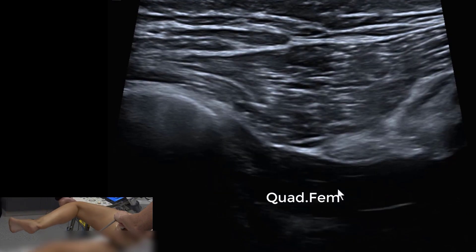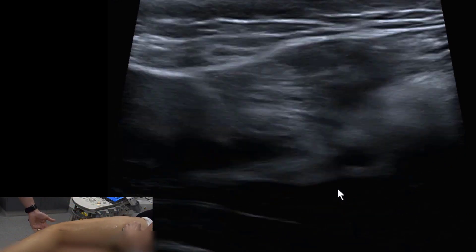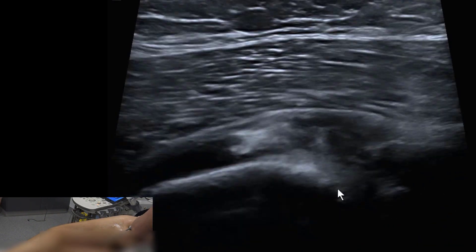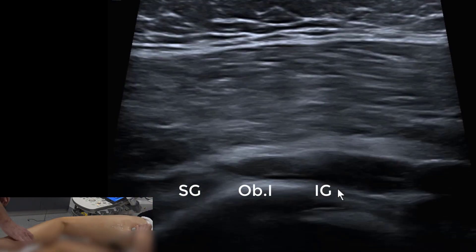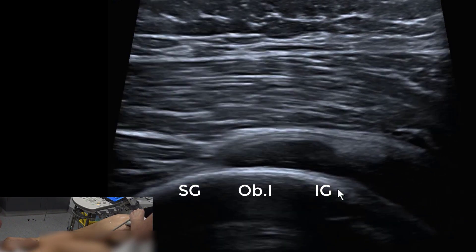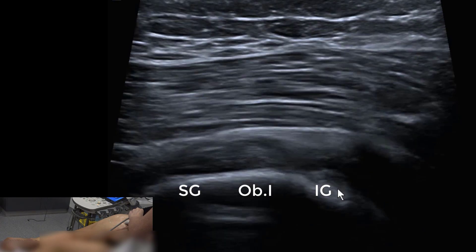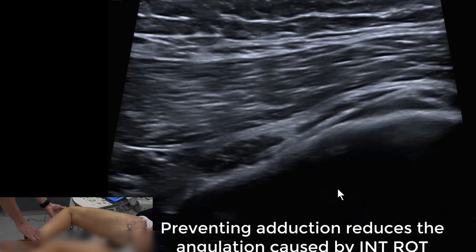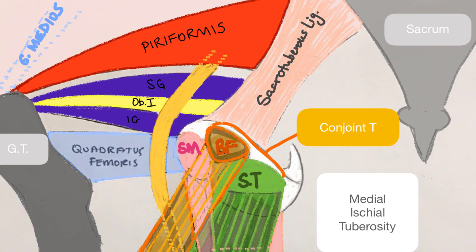Be mindful that small dips in the longitudinal plane are normal. If the knee falls toward the table during hip flexion, you will see more kinks in the nerve than if the knee is supported. With the knee supported and internal rotation reduced, we can observe the nerve through various passive movements and see what is normal for a functional, asymptomatic patient.